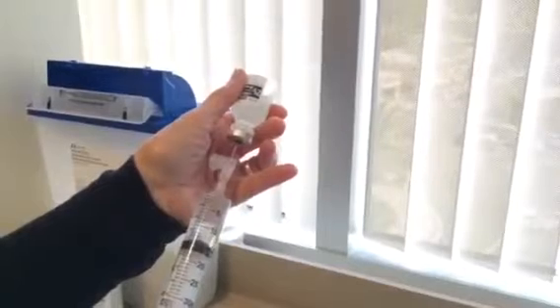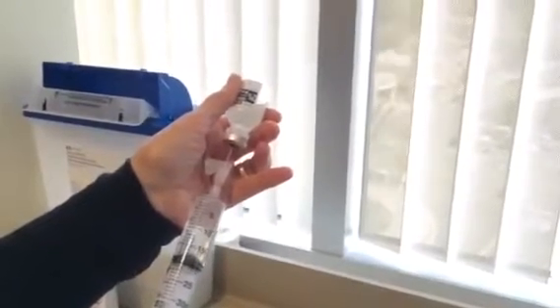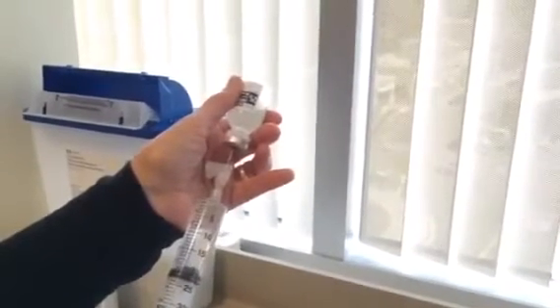And then 200 mg of lidocaine. The dose in mg of lidocaine seems to be the important part, so if you don't have 2% available, you could use 20 cc's of 1% lidocaine, and that would also be 200 mg.